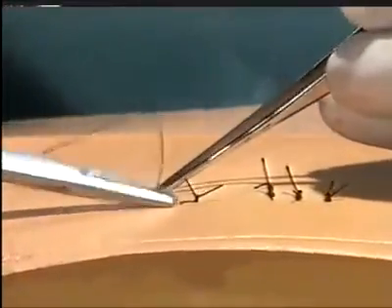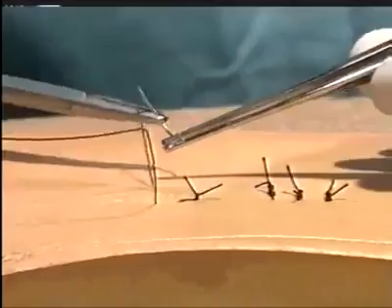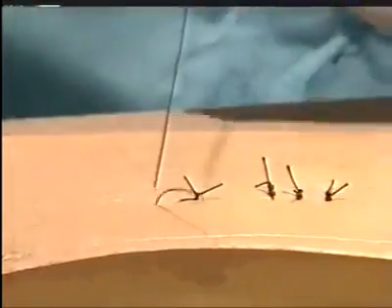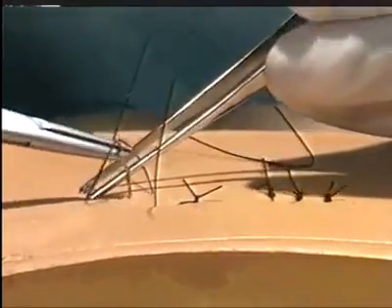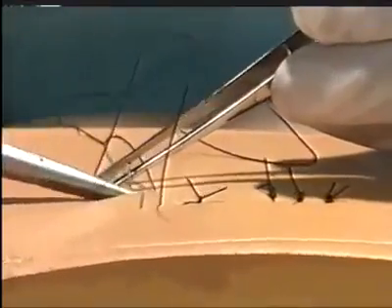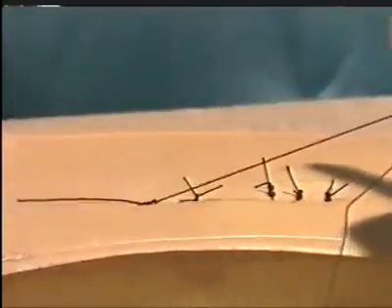We will now insert another horizontal mattress suture. The suture is inserted in the standard manner. The needle reversed. And then returned to the opposite side of the wound parallel to the initial traverse. The suture is then secured with a reef knot.